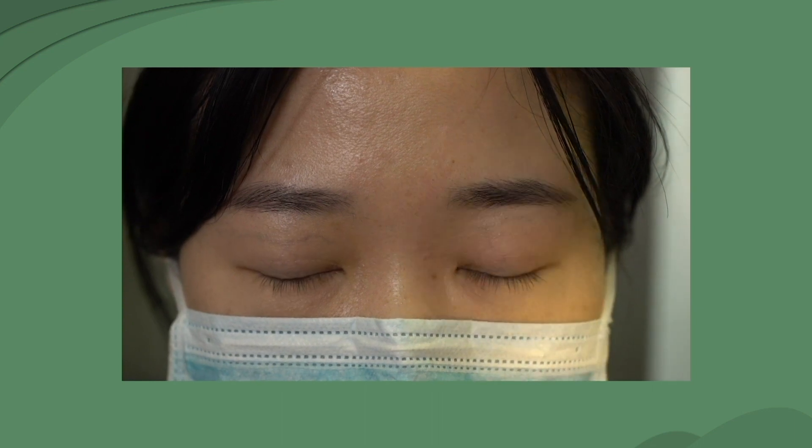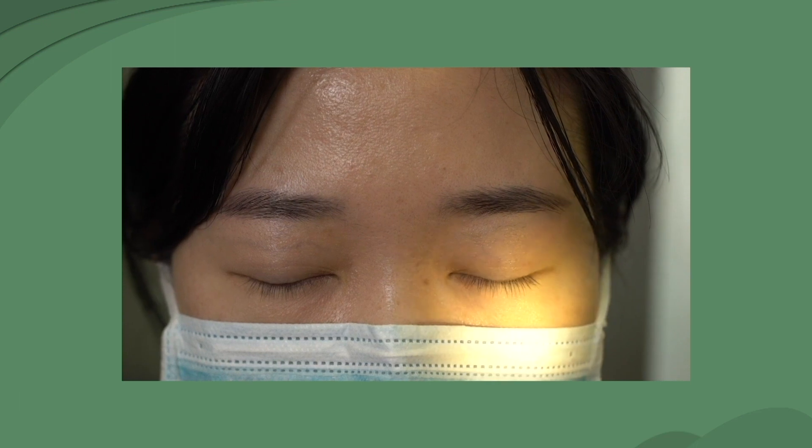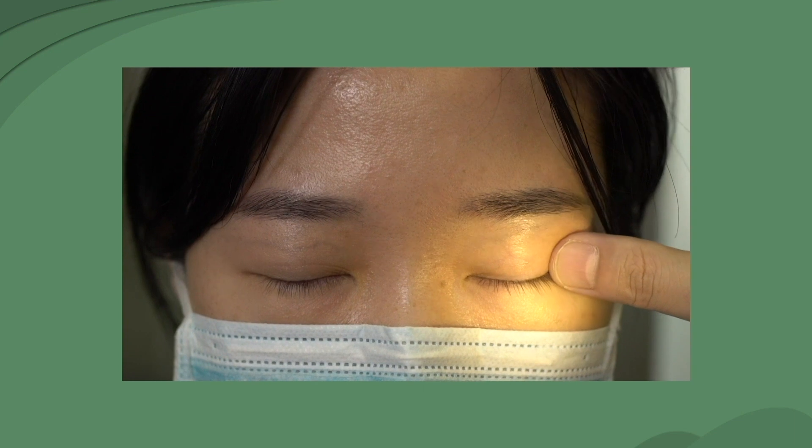An external eye examination can be performed with a flashlight. For the eyelid, observe whether there is redness, edema, congestion, ulcer, scar, mass, eyelid margin erosion, eyelid inversion, trichiasis, eyelid ectropion, ptosis, size of the eyelid fissure, closure, and so on. Use a clean finger to feel the eyelid to check whether there is any mass in the upper and lower eyelid.